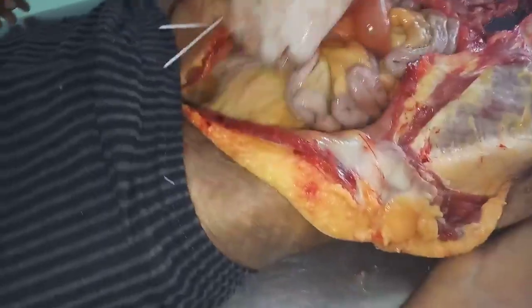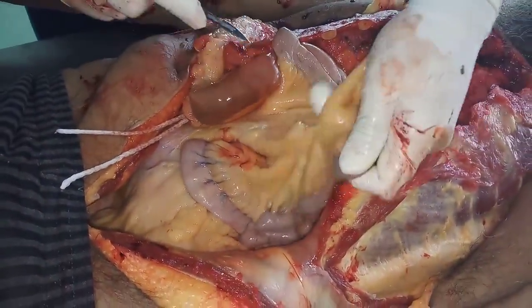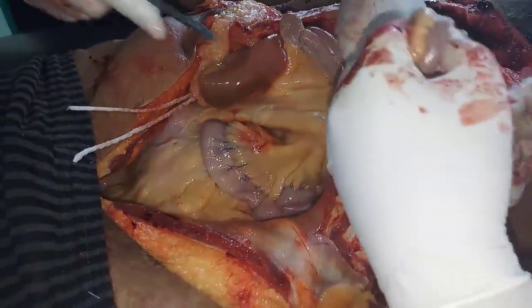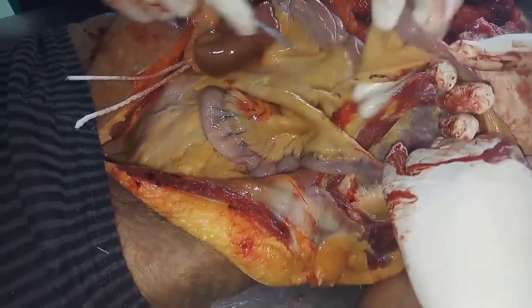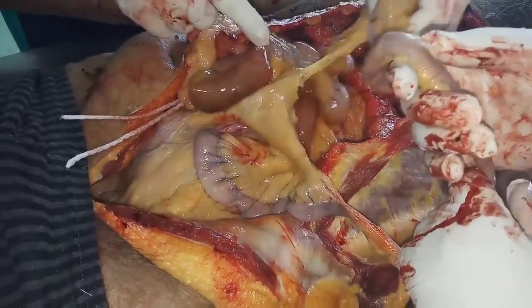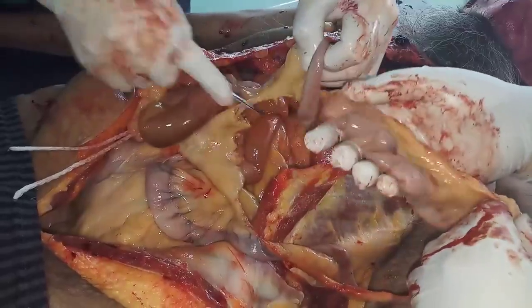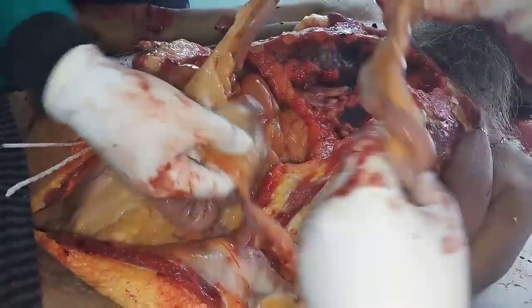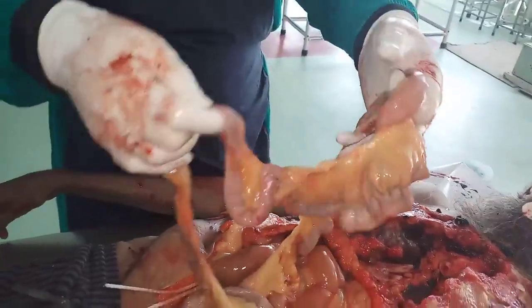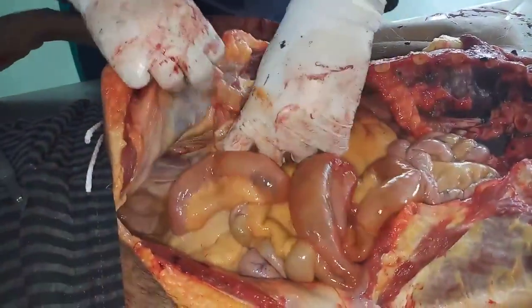Now I'll just show you some anatomical structures. This is the small intestines, the mesentery. We can even cut this mesentery and I can show you, just keep on pulling it on one side. You can see how long this small intestine and mesentery is. Okay. So this whole thing, I am showing you the small intestines and mesentery. On this side I will show you the cecum.